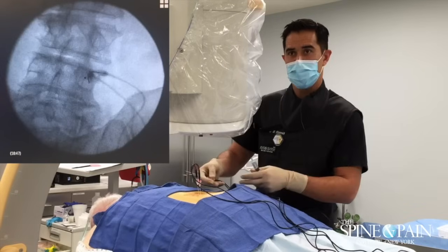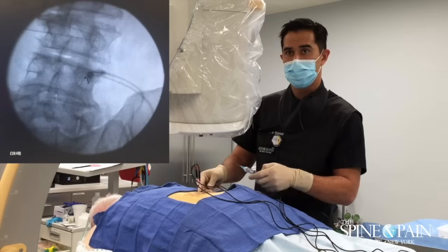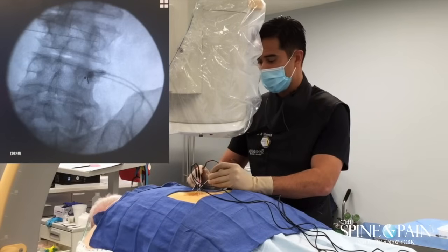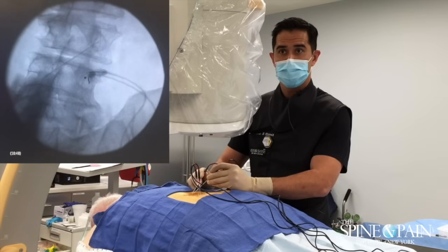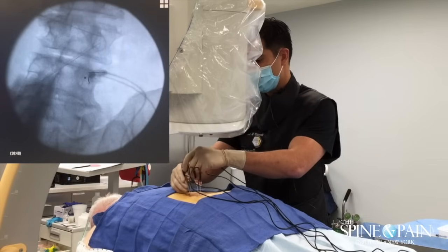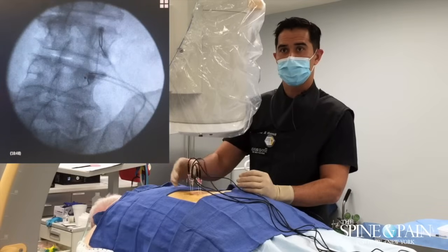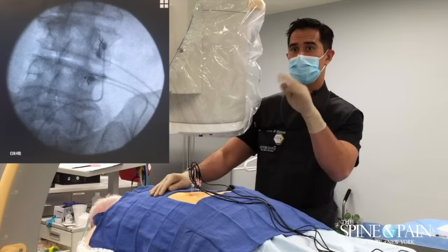We're doing the same thing with this level here — it's the level of the pedicle. That circle you see is actually the three-dimensional view of the pedicle underneath what we're doing. That's the marker, so we're at the upper right-hand corner of it. Again, same thing, and we'll oblique the camera for a second.